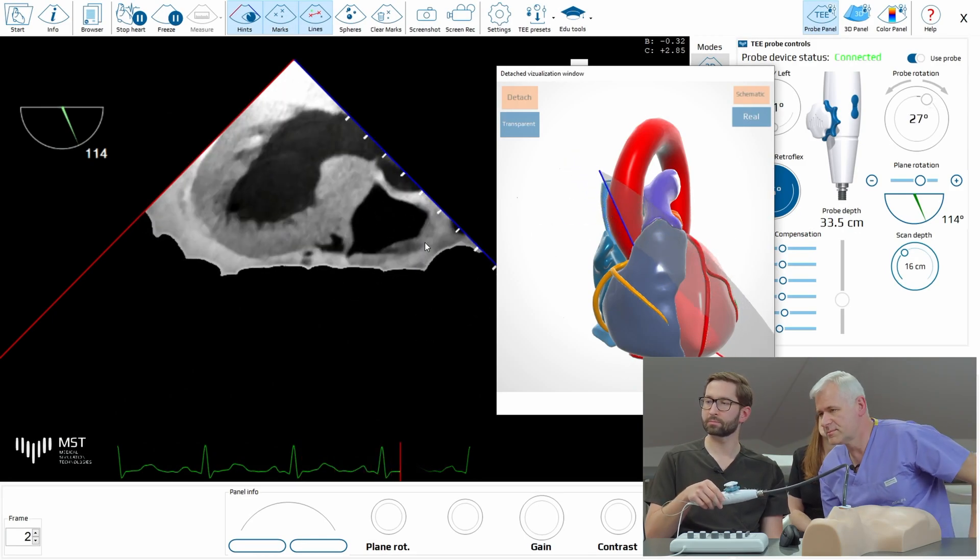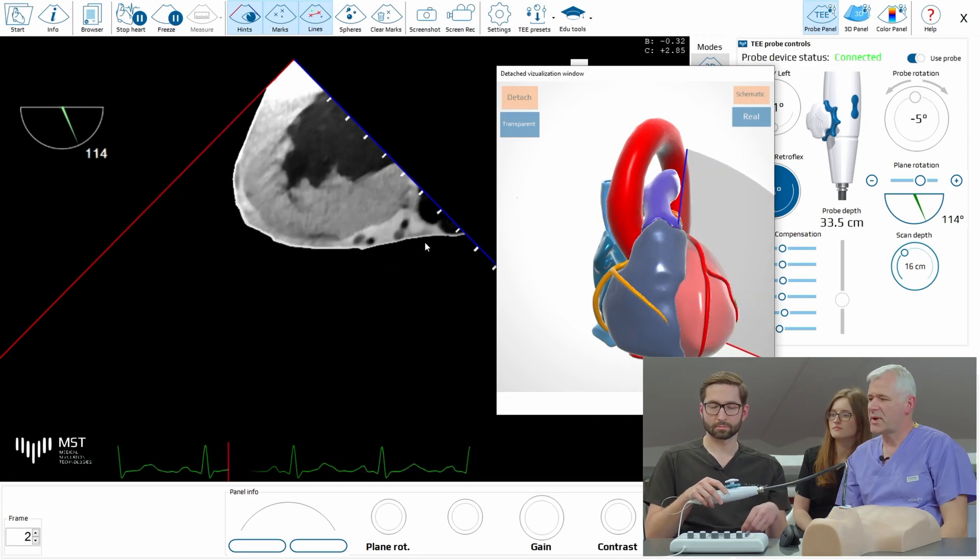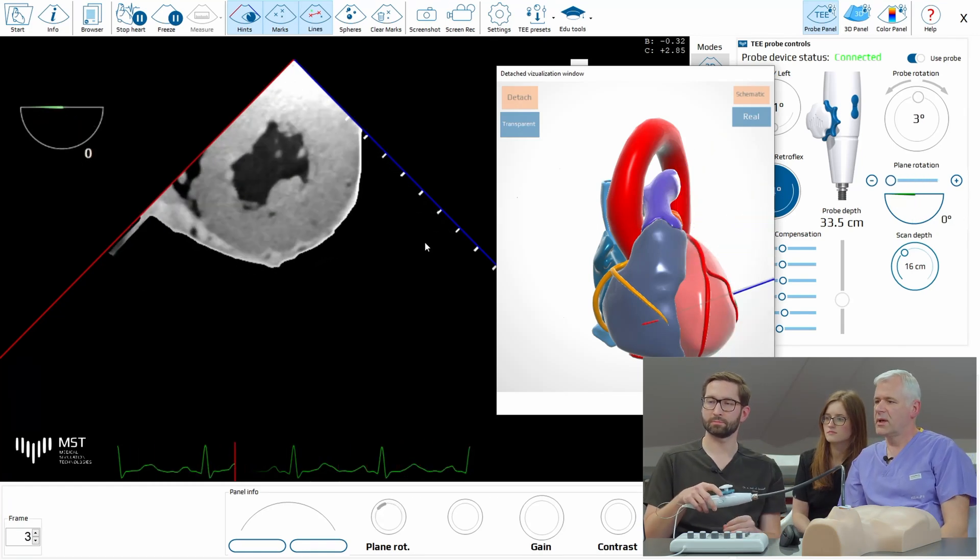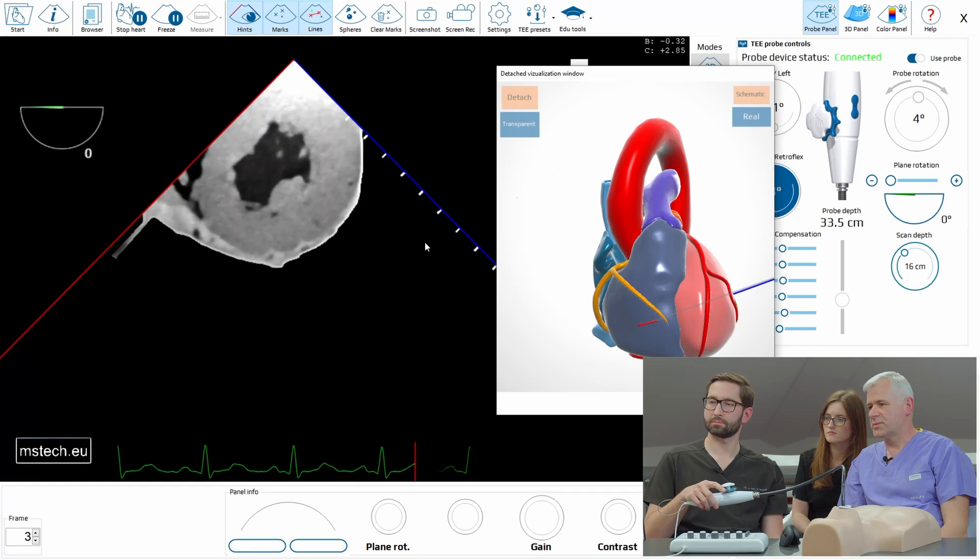Come back to zero now. Come back to the short axis view of the ventricle. And now let's go to the stomach deep.